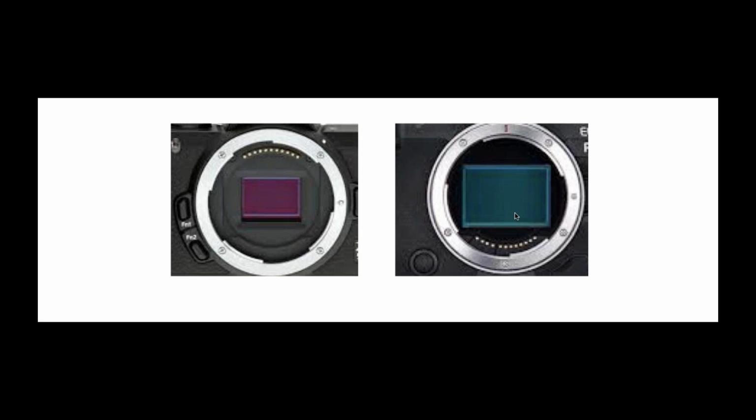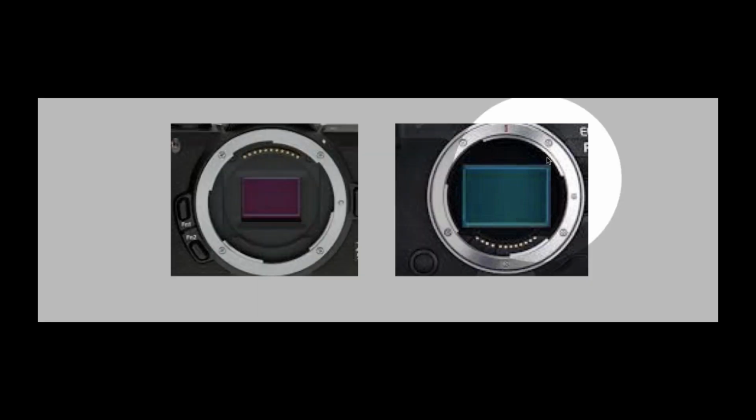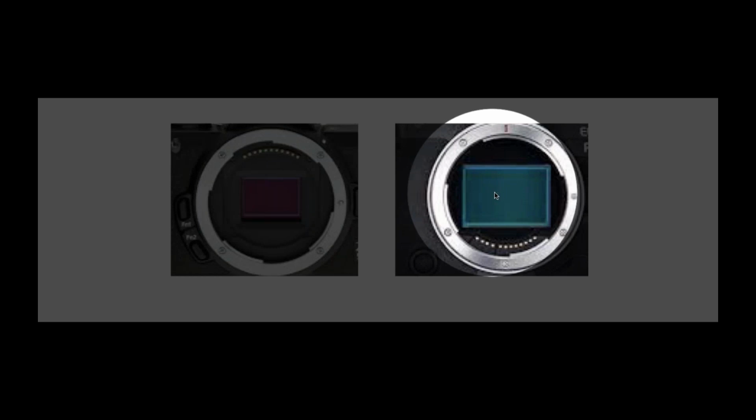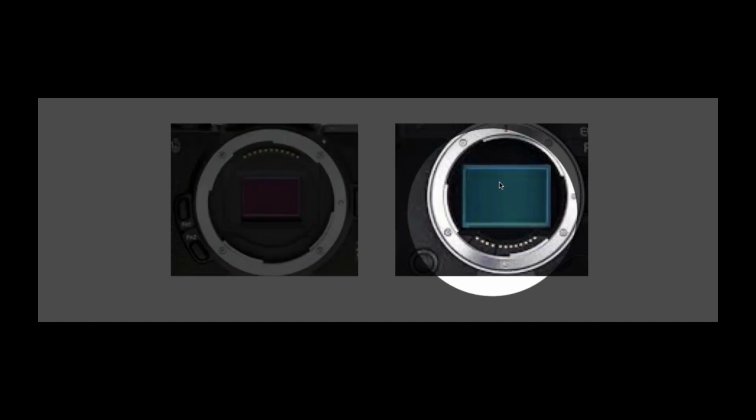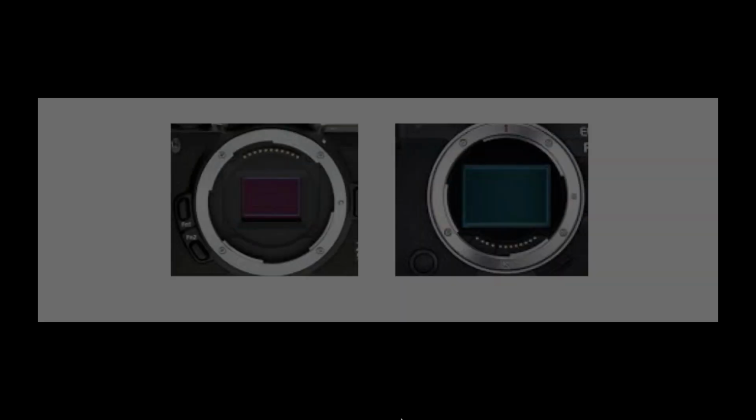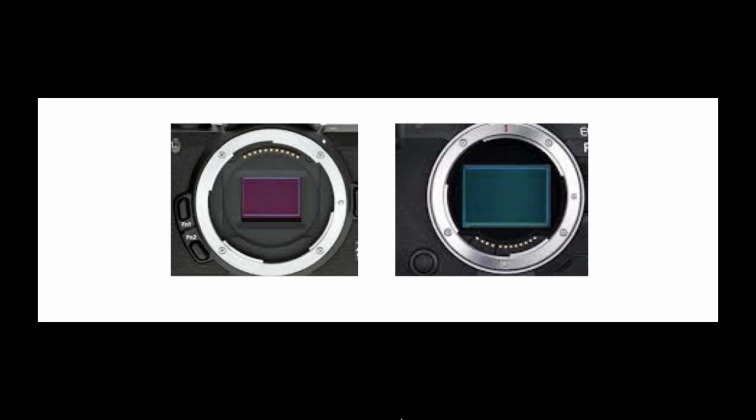I'm only shooting with full frames. I think the full frames are much more cost effective than they've ever been. And there seems to be no real difference in saving a few $100s or $200 today and not going full frame cameras. So I've switched my opinion on that over the years, and I really would rather see you shooting with full frame cameras. They capture much more information and they have a much larger surface of pixelization for us to keep that information on. So the full frame bodies are much better, more useful tools for us.